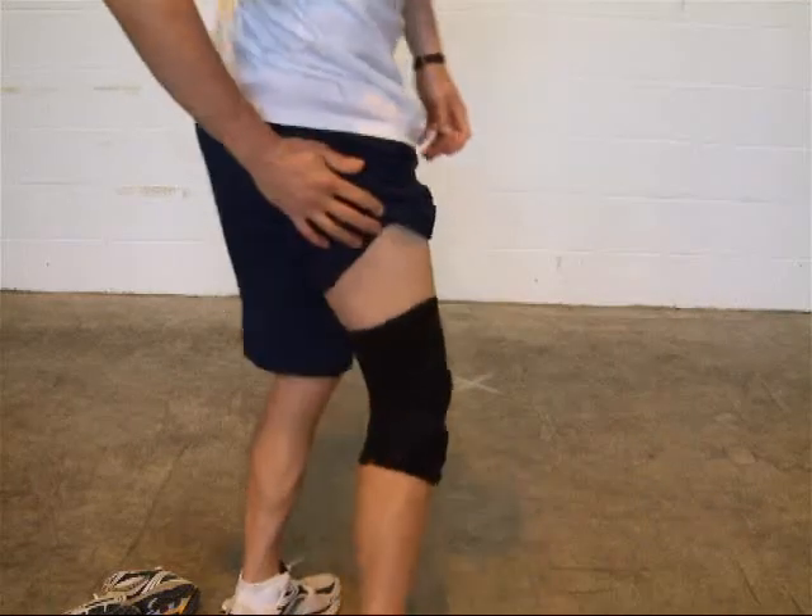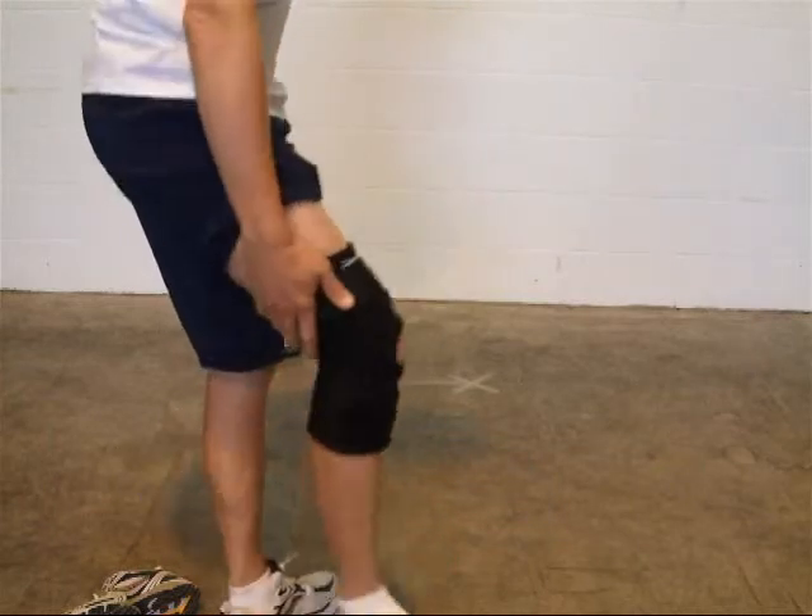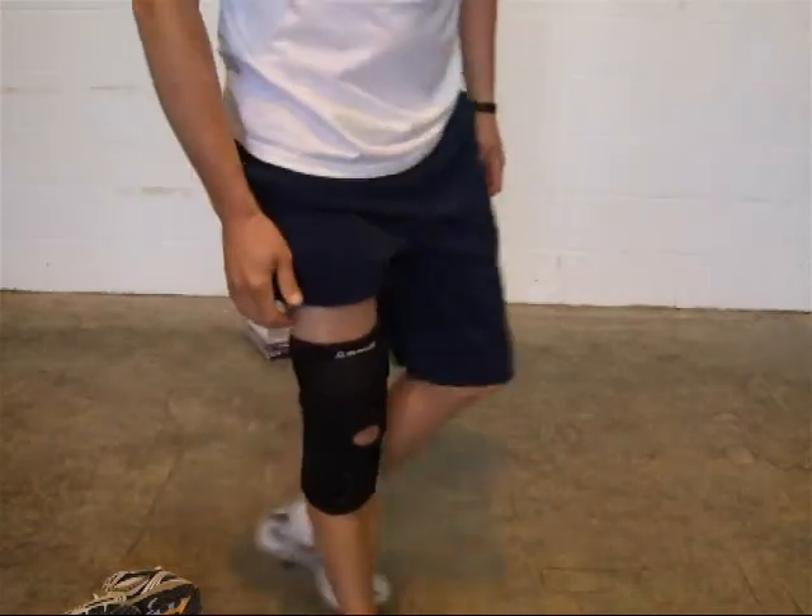That's now on — comfy, with a nice fit to the back of your knee. It's a really comfortable brace.